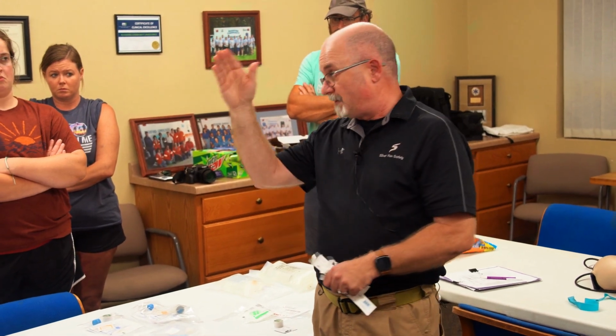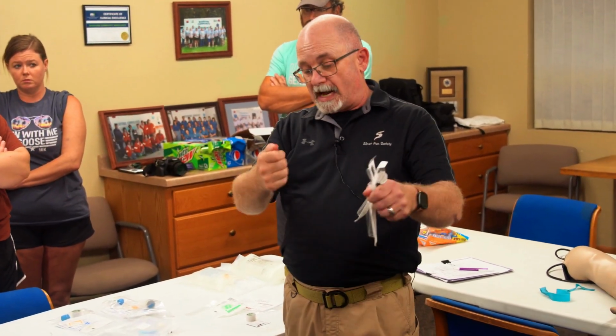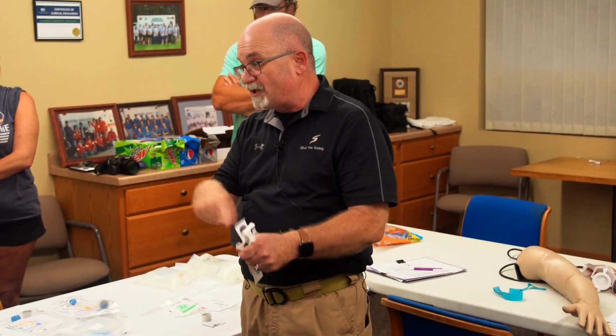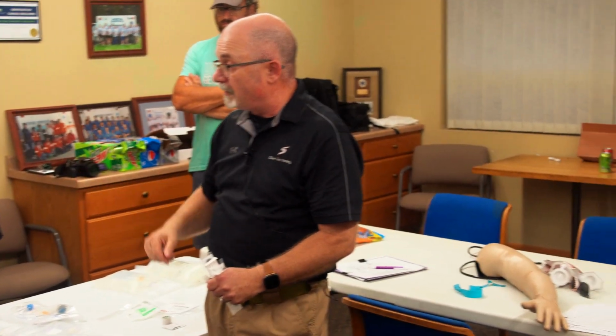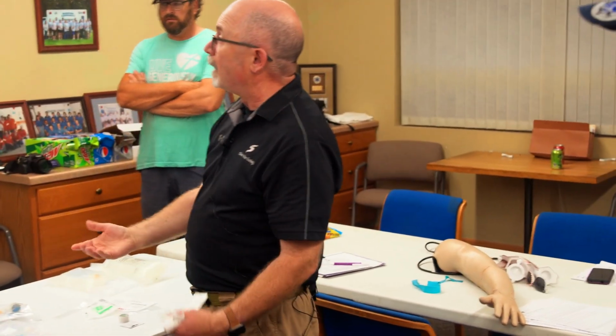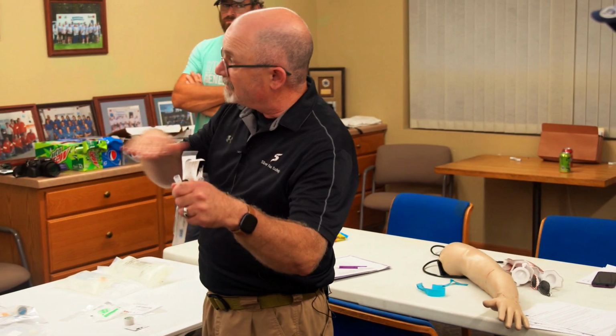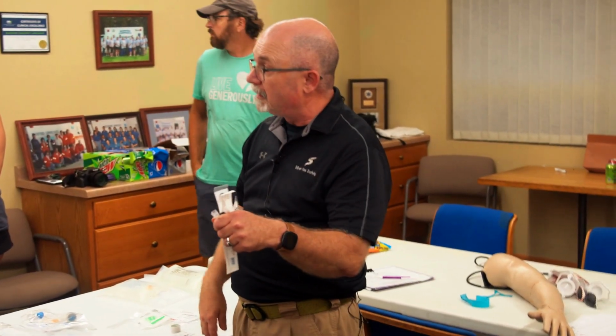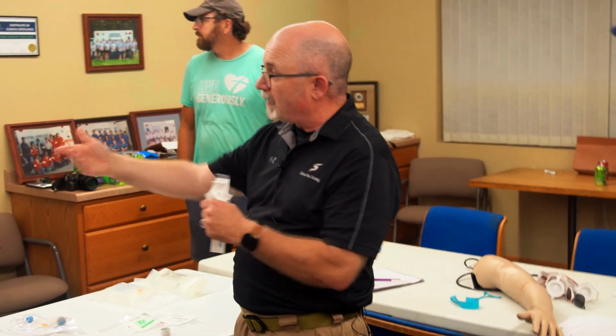When I hand off to you as the nurse in the ER, I want to be able to say, this is my first liter, I'm about 700 in. So when I chart 700, I hand it off as 700, so that they're not coming back and saying they fluid overloaded them because they didn't know where I was at. Or I only put 100 in and documented 100, and they didn't keep control of it and ran a whole liter in. It doesn't happen often, but that's what I'm trying to avoid.